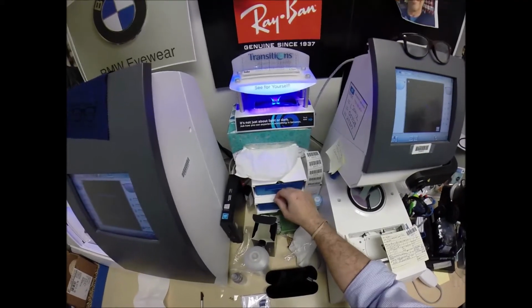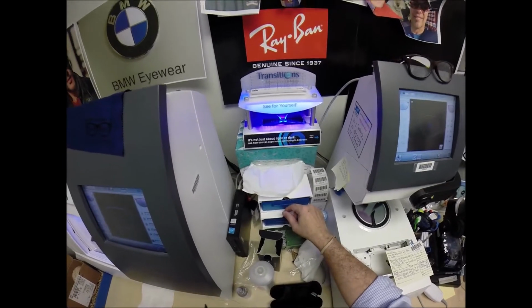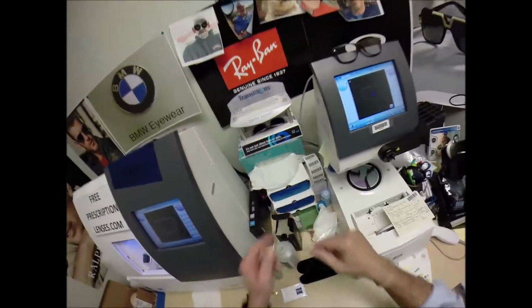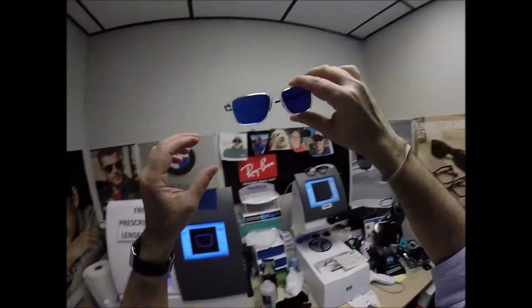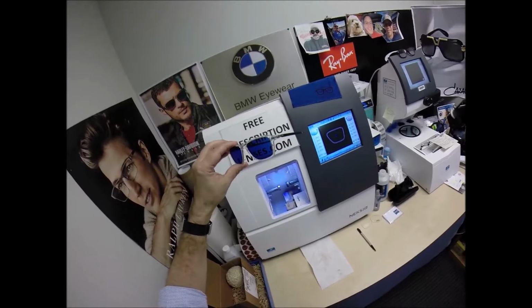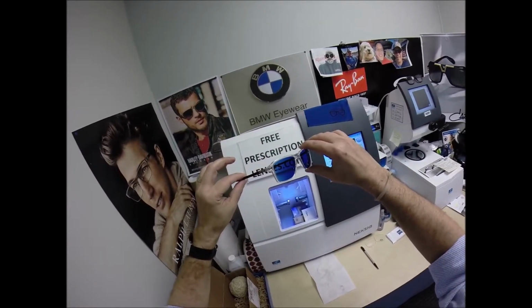Now this is important, everyone pay attention. All photochromic transition lenses will turn dark on day 1 and continue to darken every day for the first 2 weeks they're exposed. After that, they will work for years at maximum performance. The only time they won't work is if you're behind the windshield of a car. Your windshield absorbs the sun's harmful ultraviolet rays that would cause your dashboard to crack from sitting in the sun all day, and that's why they don't turn dark in a car.